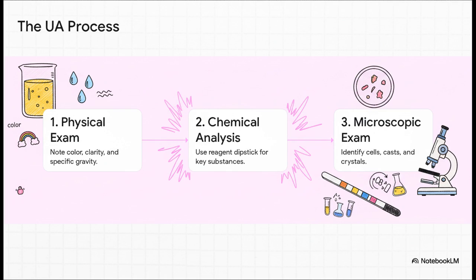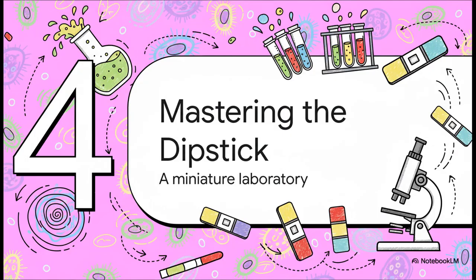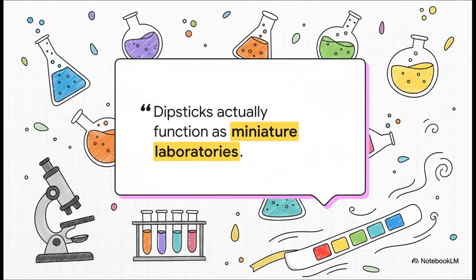And finally, there's the microscopic exam, where we centrifuge the urine and look at the sediment under a microscope to find cells, casts, crystals, and all that good stuff. And that brings us right to the main event, section 4, mastering the dipstick test. I'm telling you, this little strip of plastic is one of the most powerful and efficient tools in the entire clinical laboratory. I absolutely love this quote.